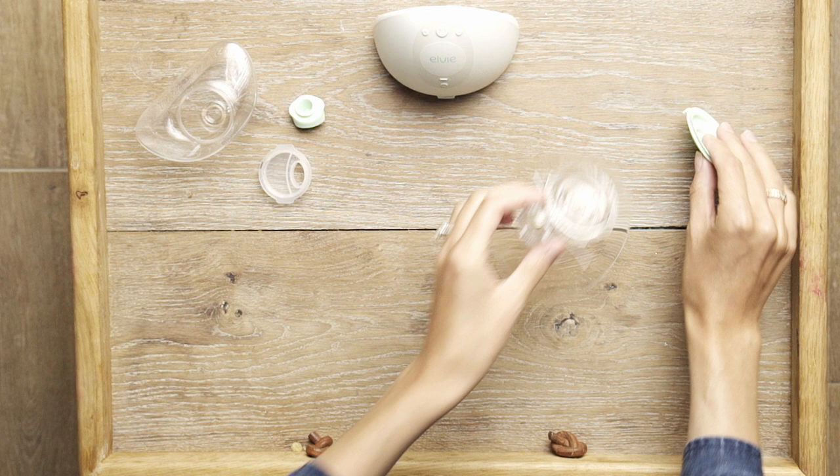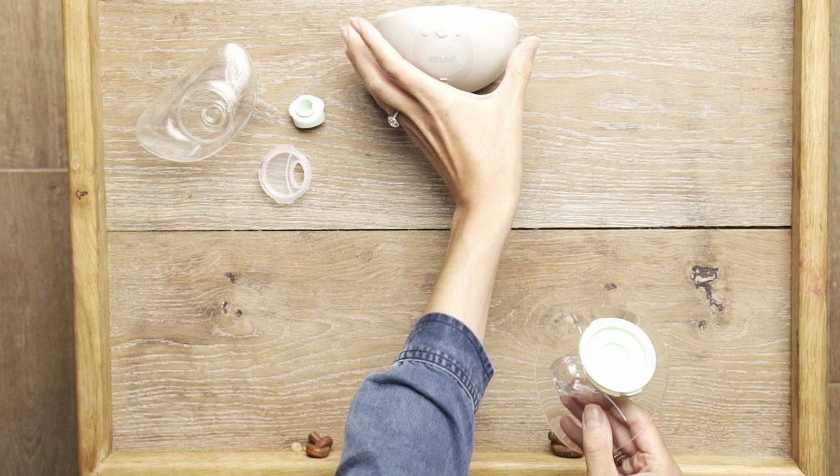Put the seal on the breast shield using these tabs to secure it in place and make sure that it's flat. Then push the breast shield onto the hub.